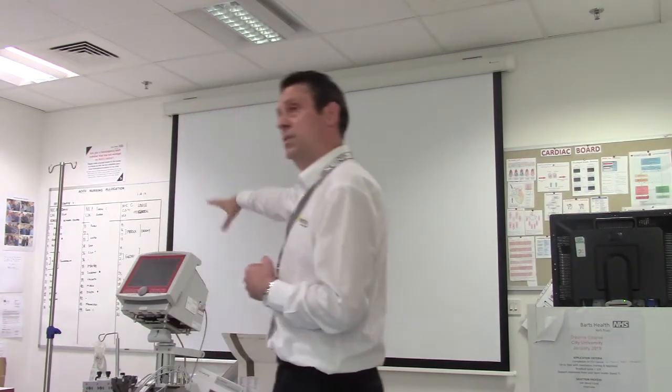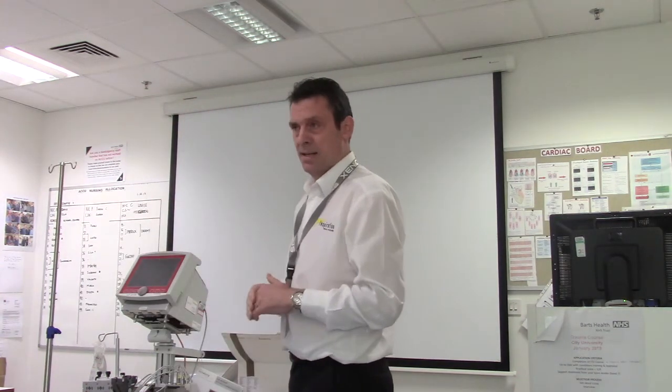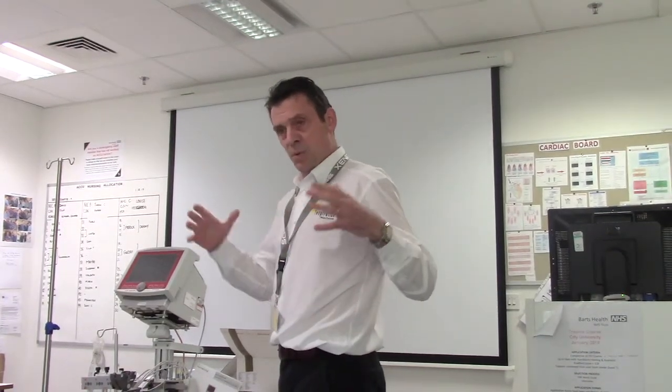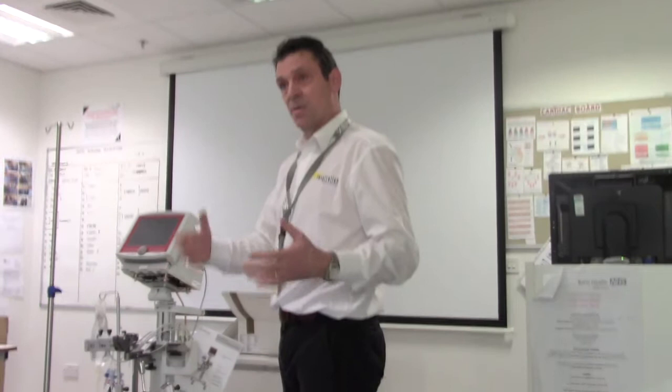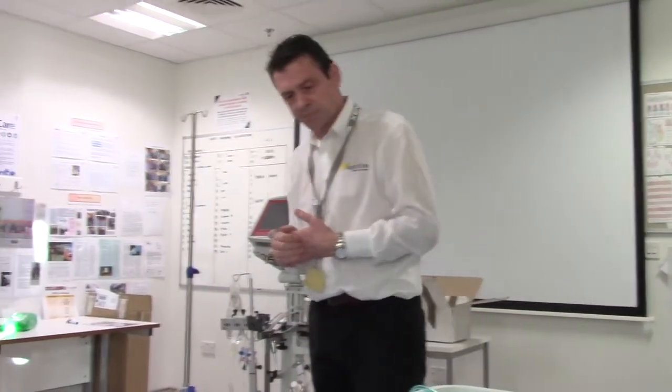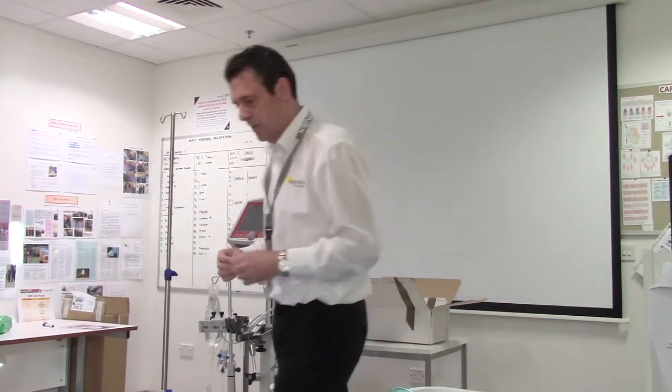If you can't see at the back when we come to do the machine, let me know and we'll all huddle around. The principle will be that I'll show you the priming of the system, then we'll put it onto the machine and go from there — any questions, just ask as we go. It's a little difficult to do this without a live system with a sterile field because it's already opened up, but we'll try and go through it as best we can.